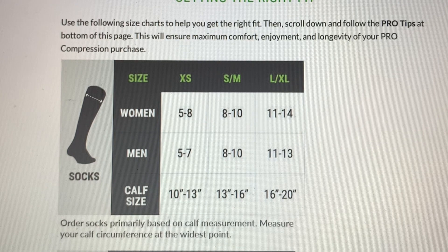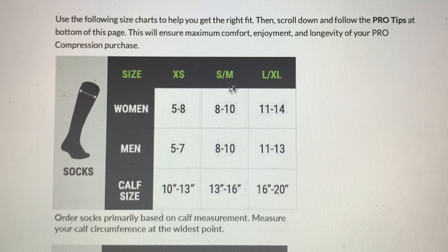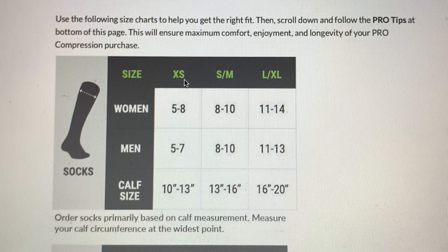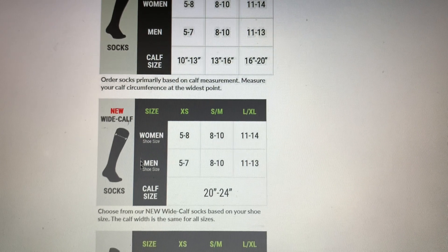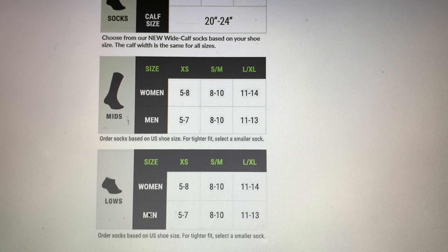On the top here is the regular full calf compression socks, and as I already mentioned, you usually only need a shoe size and a calf size for these over-the-counter sports compression socks. For example, if you were a size 7 shoe and you had a 12-inch calf, you would be an extra small. They also have the wide calf size chart.